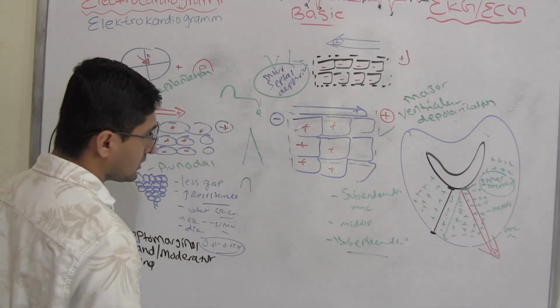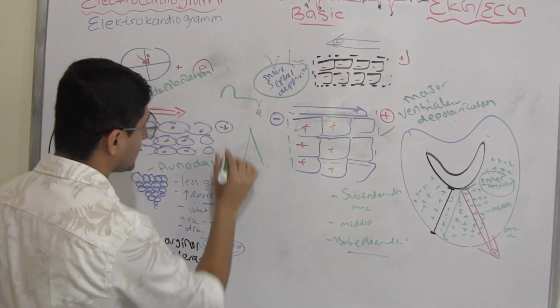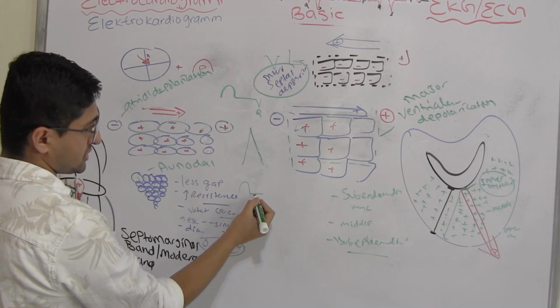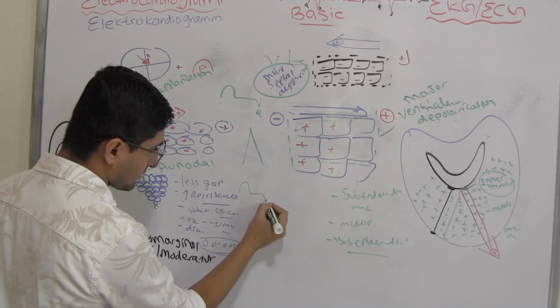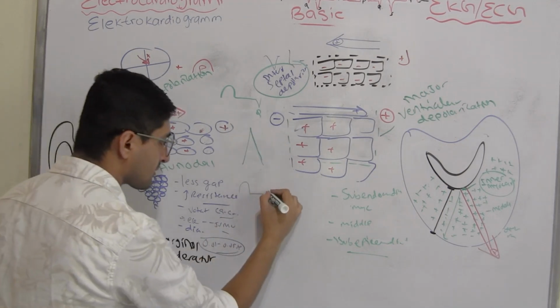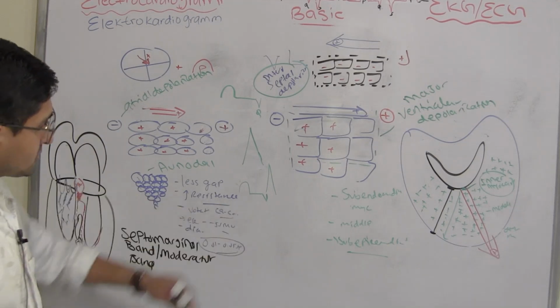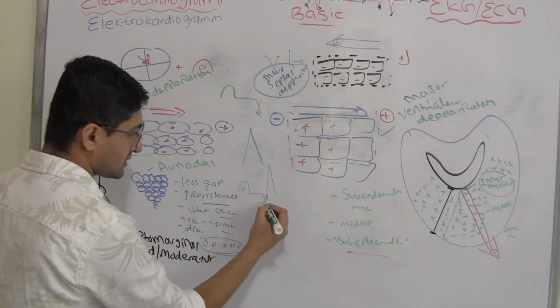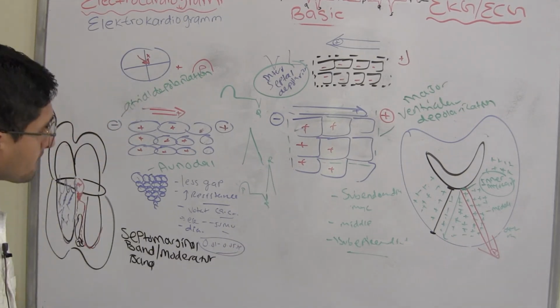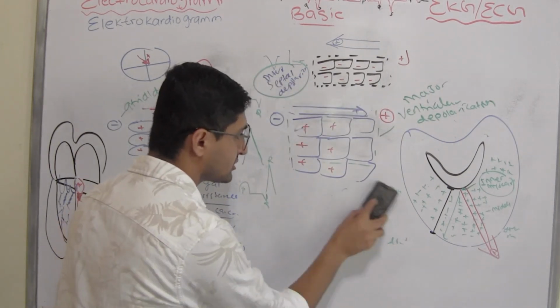Now, it will have this longer wave. So if I add all of them together, with atria I have this, right? Then I have this, which is my AV node representing, and I have a little bit of this, and then I have this long one, goes like this, right? So now this is P, this is Q, this is R, and we haven't talked about the other one. Now, let me erase this part for now, okay? Hopefully you understood this part.